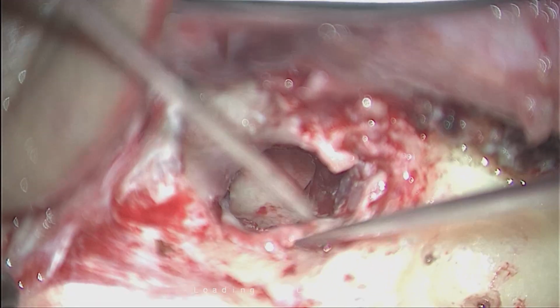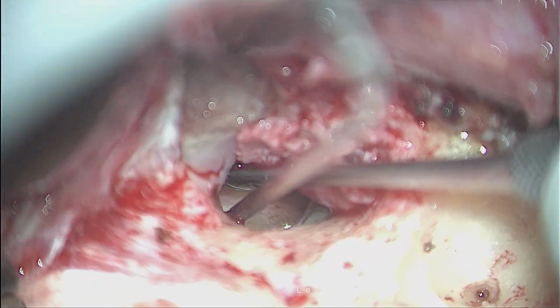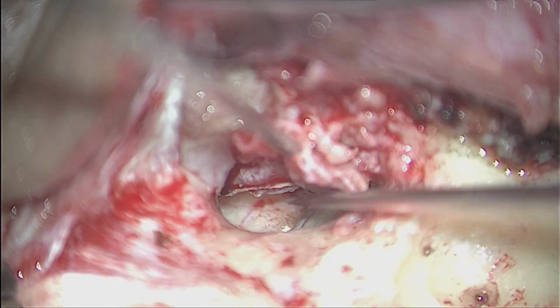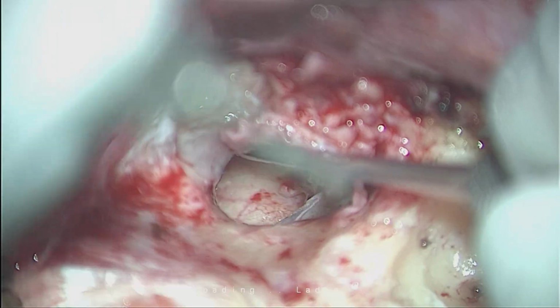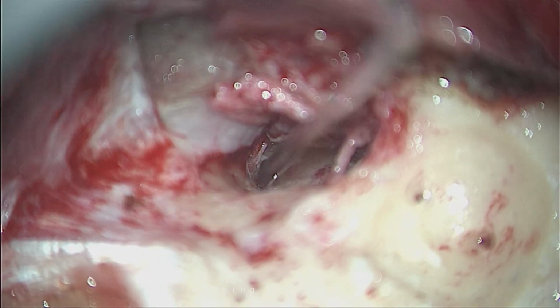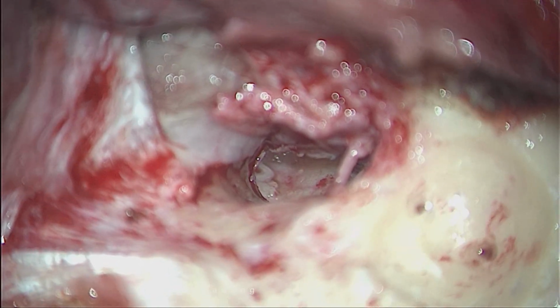Once you have found the patency, at least you can be 100% sure now that you have checked the entire mucosal cleft. The goal is to address the entire mucosal cleft, which I told in the beginning. Now my bed is ready for the grafting. Can you see? Yes, sir. And immediately after this, we'll be starting the cochlear implant case.